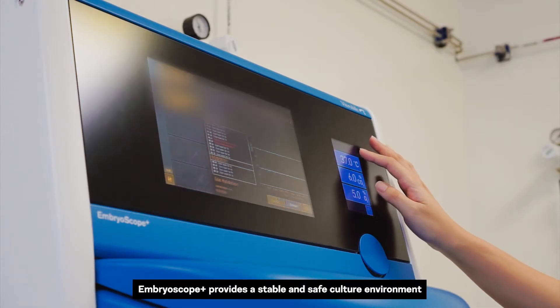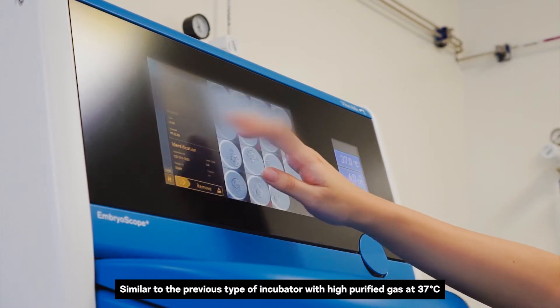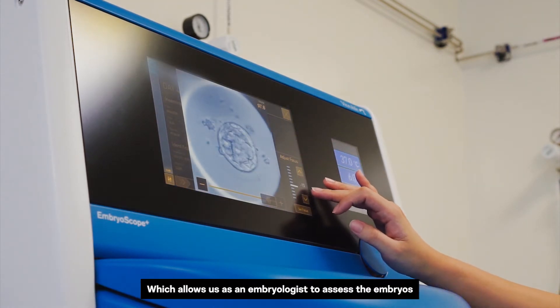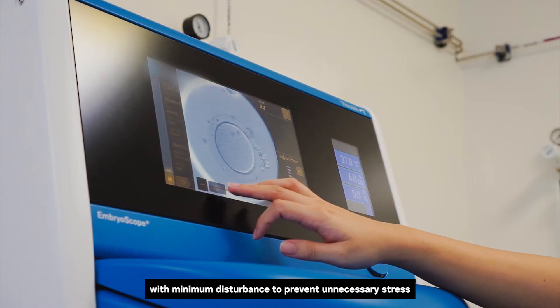Embroscope Plus provides a stable and safe culture environment with high purified gas at 37 degrees Celsius. Images of all the embryos are captured and can be observed in multiple focal planes, which allows us as embryologists to assess the embryos with minimum disturbance to prevent unnecessary stress.